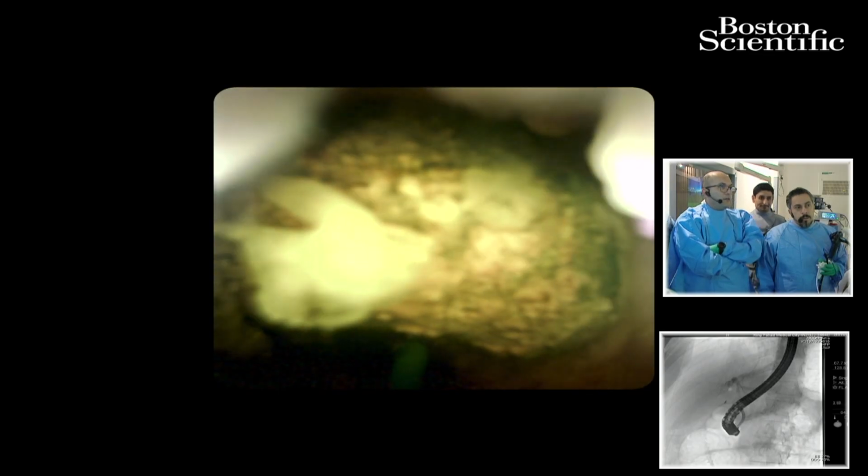You put a lot of water here. My question to you: I have plenty of sickler patients with very high hemoglobin SS and rocks in the right hepatic duct, the left hepatic duct and the common hepatic duct. And I usually bring them every 3 months.